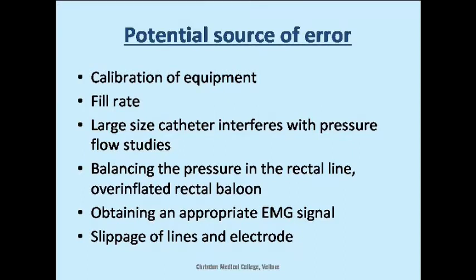Your calibration of the equipment is the most important thing. If you have calibrated zero not to the atmospheric but after putting the catheter, your entire study is invalid. The International Continence Society wants you to zero the pressure to the atmosphere, not by connecting it to the bladder. I've seen this mistake being done many times by many people. So it's important that you follow a very standardized protocol every time so that you get standard results. Otherwise, studies between 2 people or 2 centers will be difficult to compare.